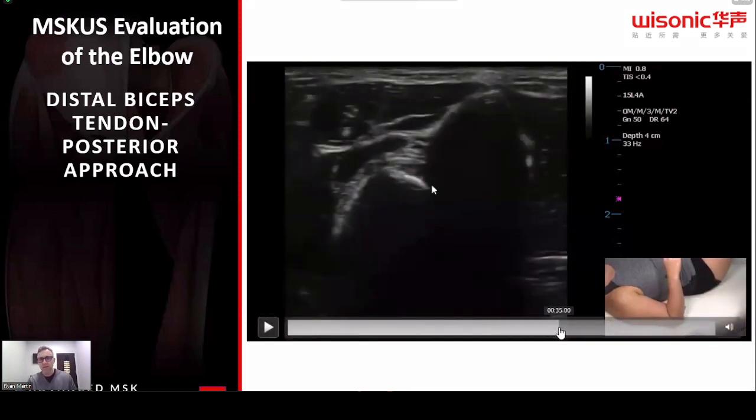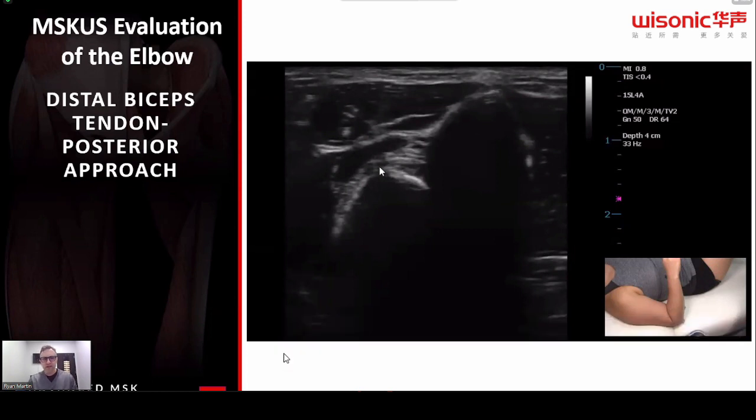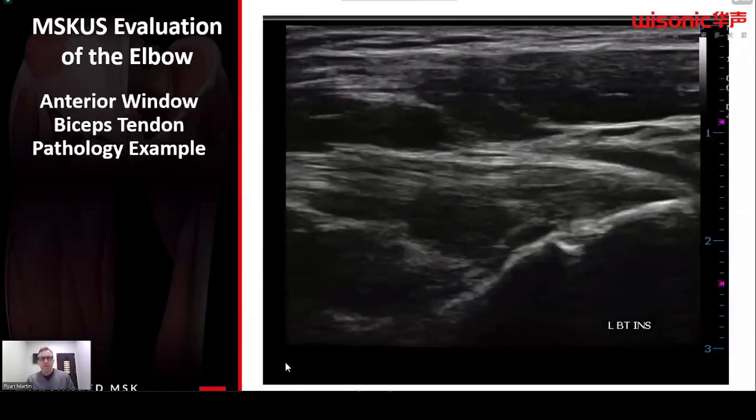So we'll go through the rest of that, but you can see where Colin is showing that distal little parrot's beak, so it looks like a little triangular shape, and that's almost the space that you would want to go right into here. The radial nerve, which is one space that you'd want to watch out for, is going to be a little over into the weeds here. You would want to clear that first, but as far as major vascular regions, you're pretty safe in this area here.